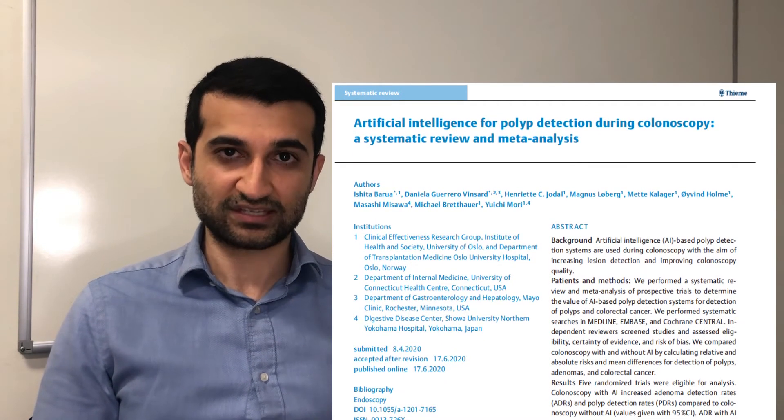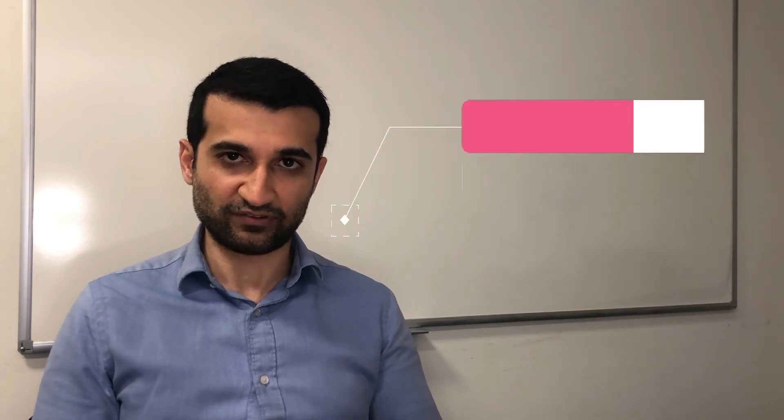What's important to note is the evidence. We're very fortunate for AI in endoscopy to have some of the best evidence out of any application in medicine. We have numerous robust randomized control trials for computer aided detection, and a number of recently published meta-analyses have demonstrated that CAD-E systems lead to a significantly improved adenoma detection rate and number of adenomas detected per colonoscopy. It should be noted that currently these improvements are largely limited to non-advanced adenomas. For polyp characterization, more limited trial data are available, but pre-clinical studies are very promising.